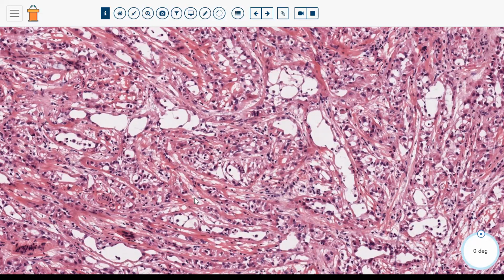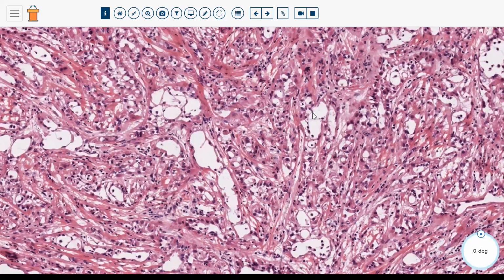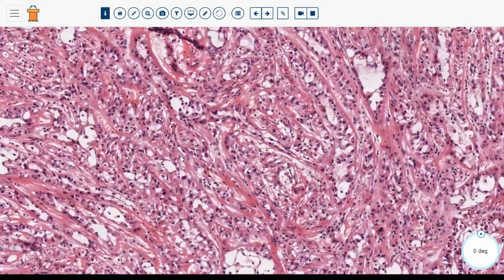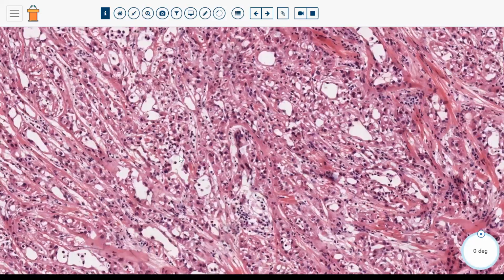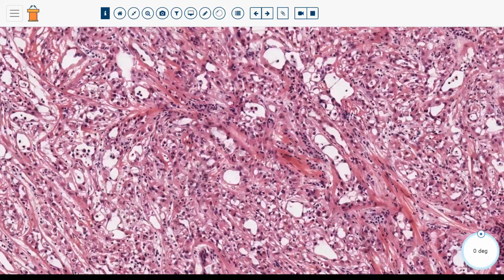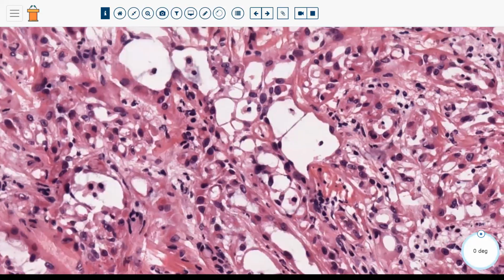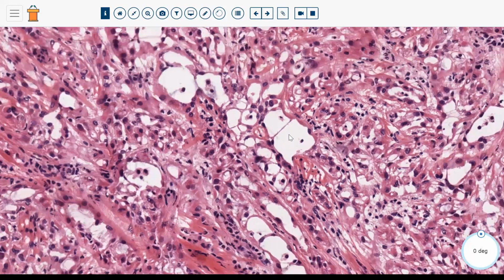And this finding of the threads of cytoplasm that are kind of bridging across the lumen of the glandular structures was described in a very nice paper by a friend and collaborator of mine, Dr. Andra Hess from the Czech Republic, under the name thread-like bridging strands. So that's a feature that is very consistently positive in adenomatoid tumor, these bridging strands of cytoplasm that go across the lumen of the gland, and that can help you with your diagnosis, especially if you're encountering a case on a frozen section like this one.